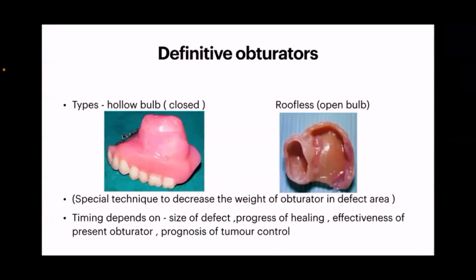When to give the definitive obturator, the timing, actually depends on the size of the defect, the progress of healing, effectiveness of the present obturator, and the prognosis of the tumor control.